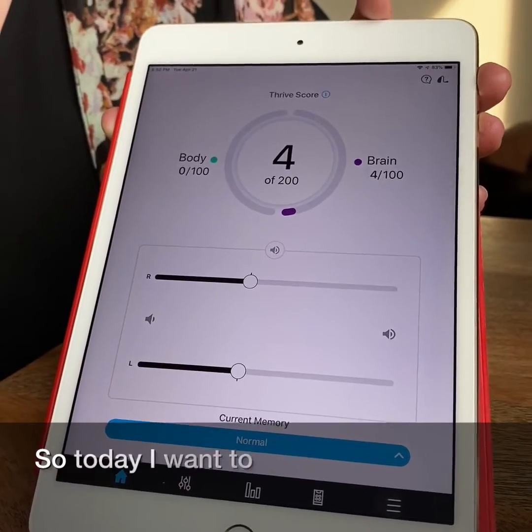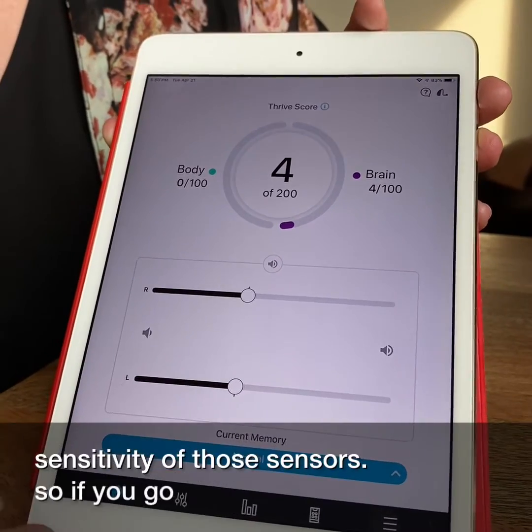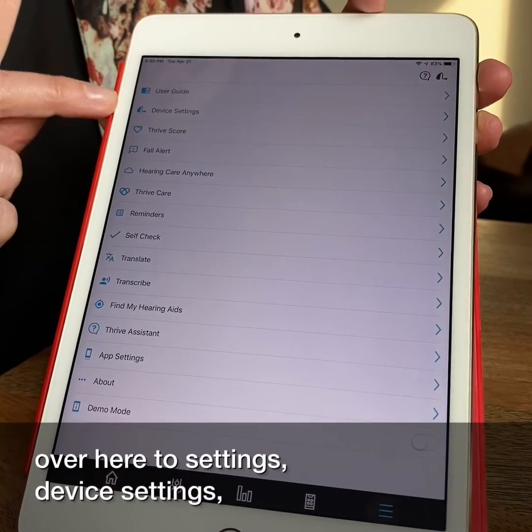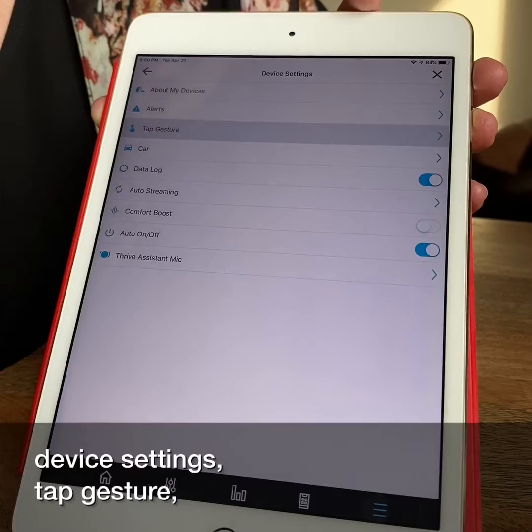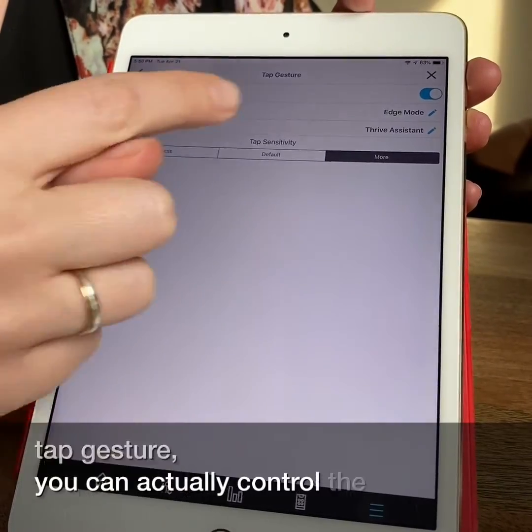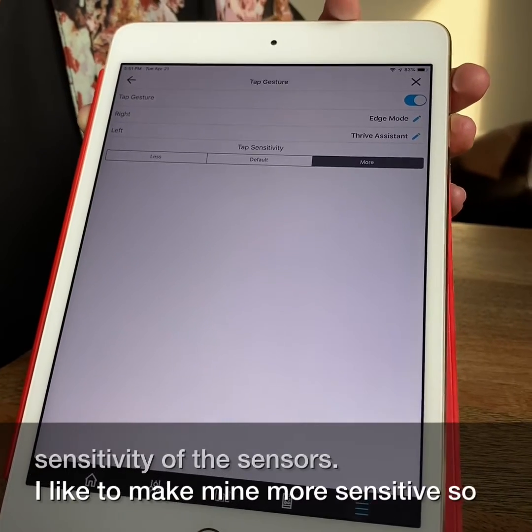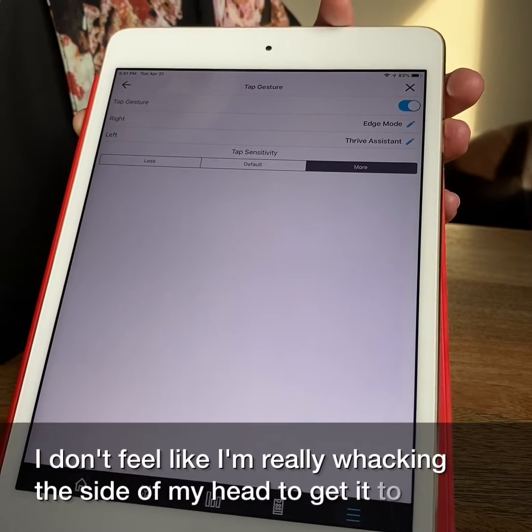Today I want to show you in the app how you can change the sensitivity of those sensors. If you go over here to Settings, Device Settings, Tap Gesture, you can actually control the sensitivity of these sensors. I like to make mine more sensitive so I don't feel like I'm really whacking the side of my head to get it to initiate.